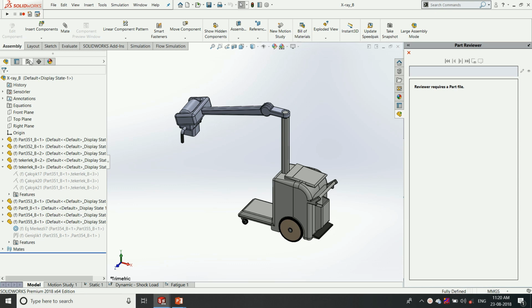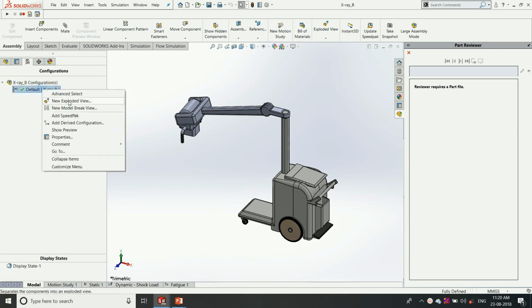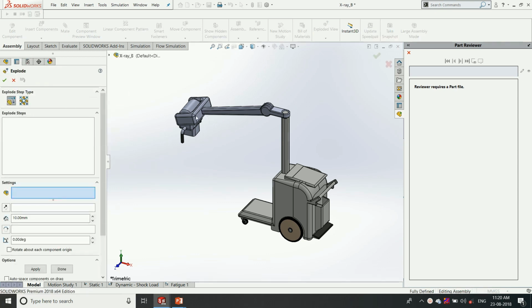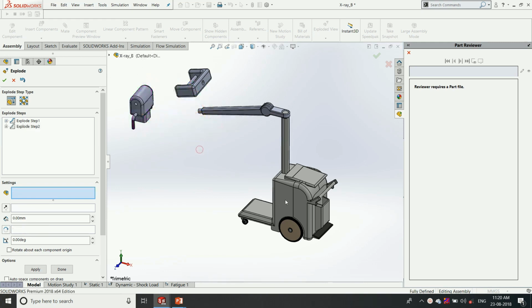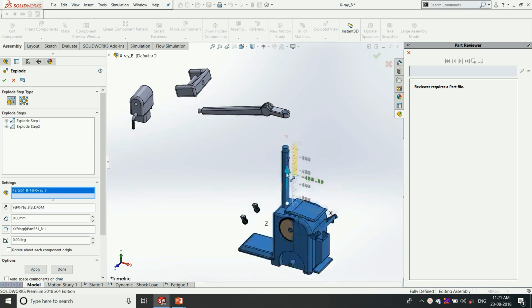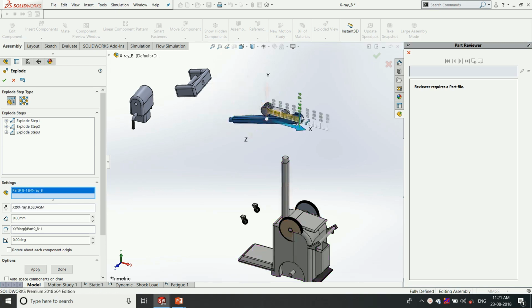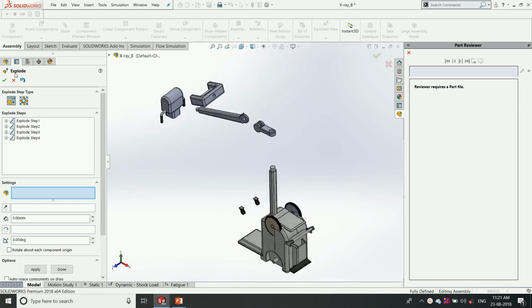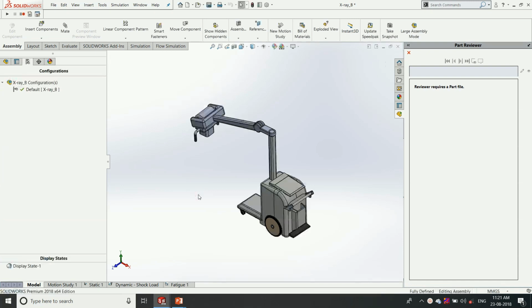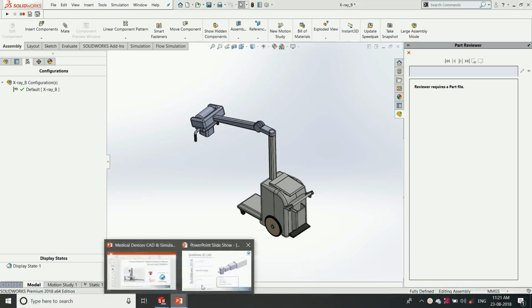In this machine we can go for an exploded view, and we can choose the components in the way in which they are assembled. This option gives us a clear view of how the components have been assembled here. These kinds of options are very useful for the manufacturers and also the end users to assemble it, or in any situation we can use this to encounter issues.